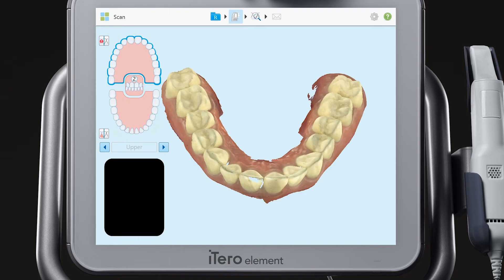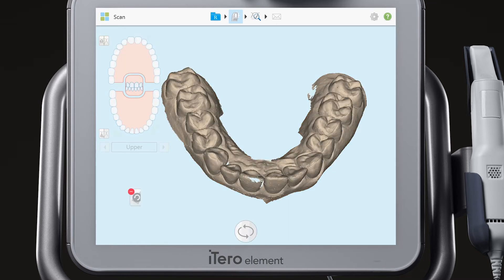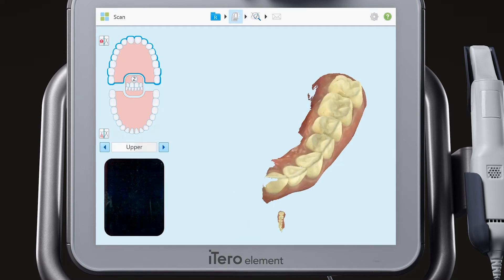If there is an area of the digital model that you would like to remove and re-scan, simply tap on the model to show the options. Choose the broom icon. Use the broom to sweep away the unwanted anatomy. Tap the scan icon in the broom dialog and scan to fill the area removed.